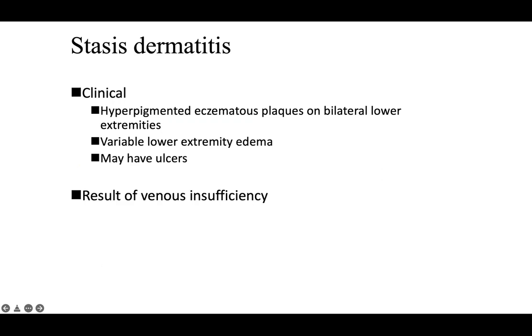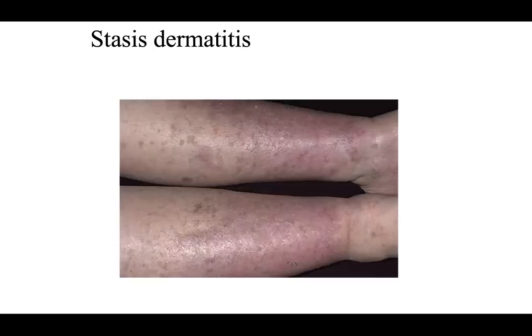So you get accumulation of fluid in the lower legs that puts stress on the blood vessels, that causes capillary dysfunction and leakage of blood cells, that causes a low-grade immune response, that also causes thickening of the vessel walls of the small vessels, and they proliferate and become arranged in a lobular fashion. So you can actually pick up on where the biopsy often is in patients, because you'll see some underlying venous insufficiency changes or stasis changes.